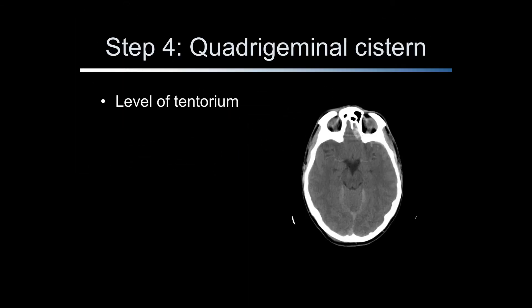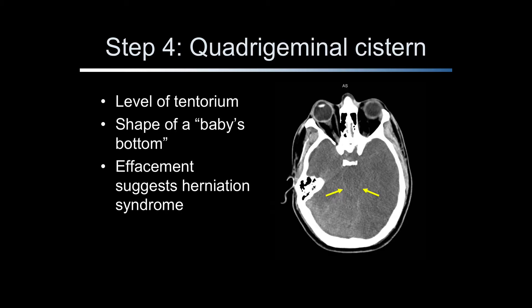Step 4 in this process is the evaluation of the quadrigeminal cistern, which is located at the level of the tentorium. It is shaped like a baby's bottom when the legs are held up as though the diaper is being changed. If the quadrigeminal cistern is effaced from mass effect or edema, a herniation syndrome is present. In this scan, the quadrigeminal cistern, indicated by the yellow arrows, is completely effaced and appears to contain blood.